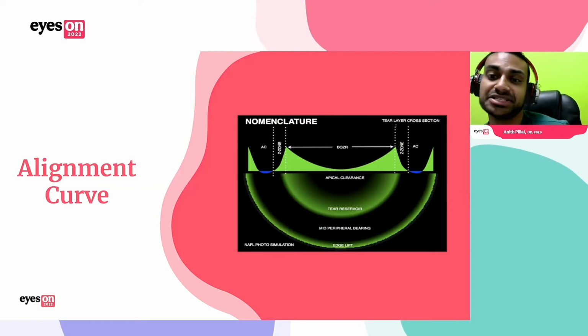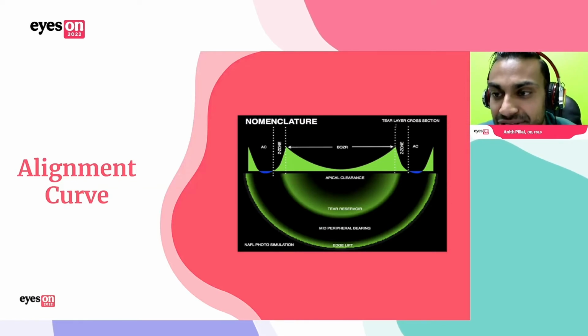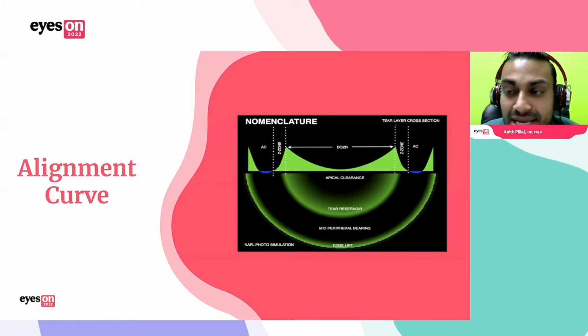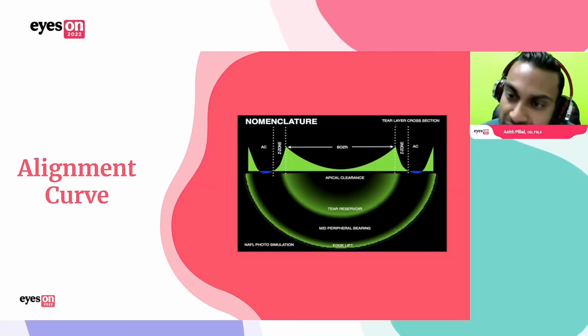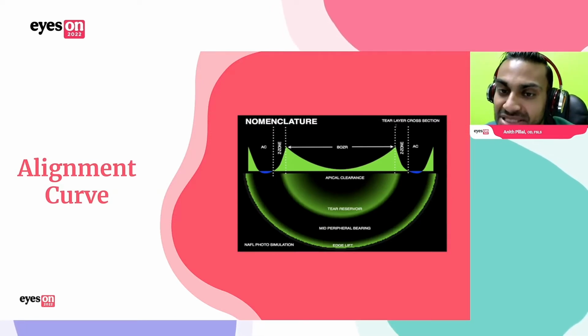On the base curve section, you'll see that thin layer of tears and then that steepening in the reverse curve. But when you come back to that alignment curve, you'll see that's pretty tangential to the mid-peripheral cornea. And that's what we want. We want this area to align properly 360 degrees around that corneal area. That's what helps the lens stay in place and center properly.